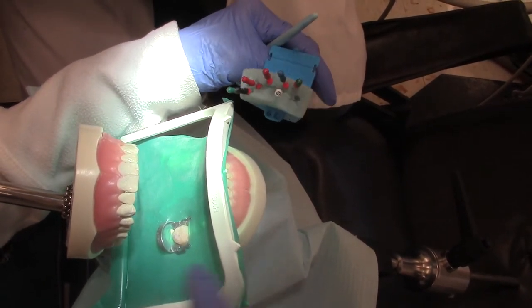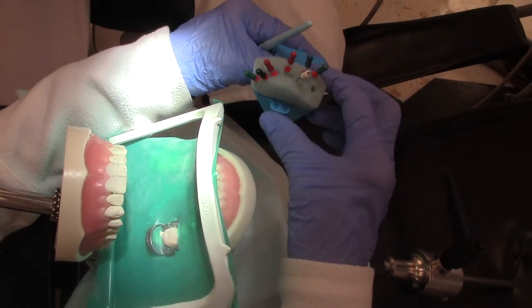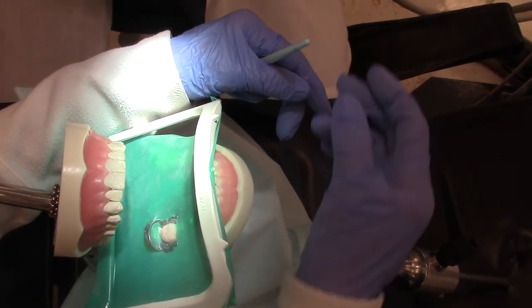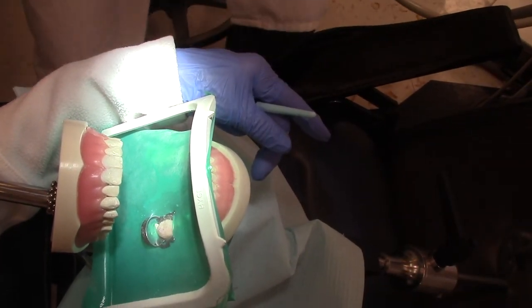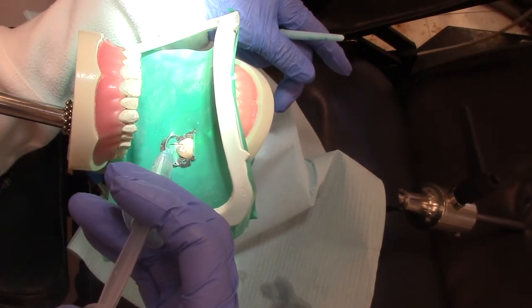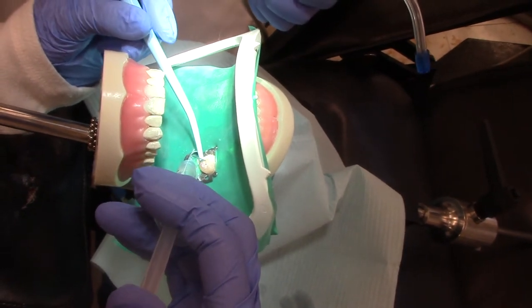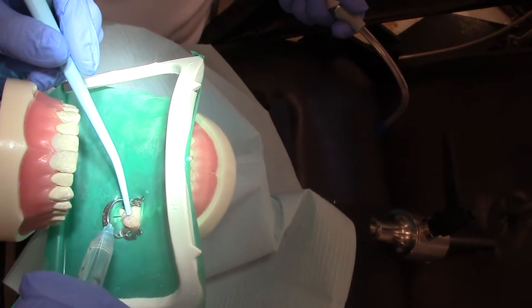Let's say that we have filed everything out — we've gone down into each canal. Now we are going to irrigate. Beth is going to give me the irrigating solution. Remember, the irrigating solution is sodium hypochlorite, which is bleach and water, and we're going to suction it out of all three canals.